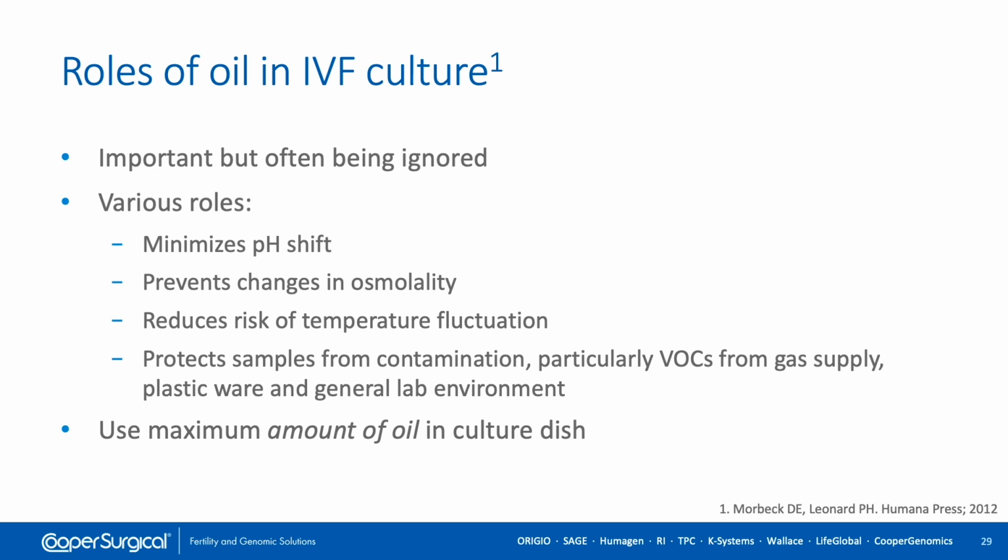It also prevents change in osmolality, and again we saw that a very small increase in osmolality can have a very significant detrimental effect on embryo development. Again, we can reduce the risk of temperature fluctuations, and it also protects the samples, or your embryos, from the outside world, particularly from VOCs, which are most prevalent in the gas supplied to your incubators, but also present in plasticware and the general lab environment, the people, etc. that are in the laboratory.